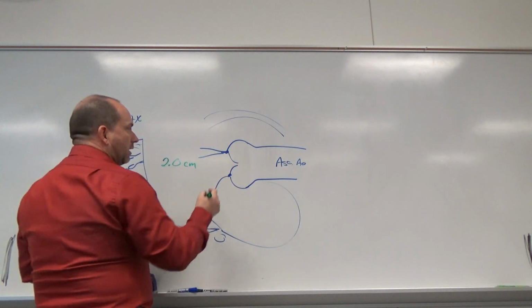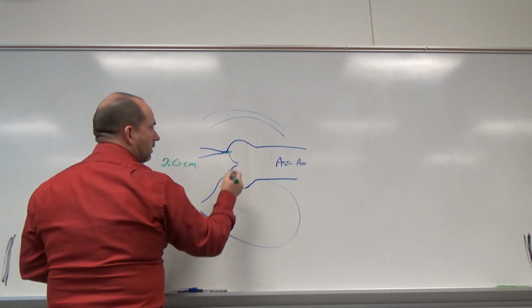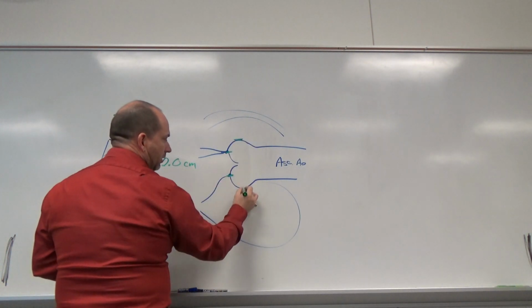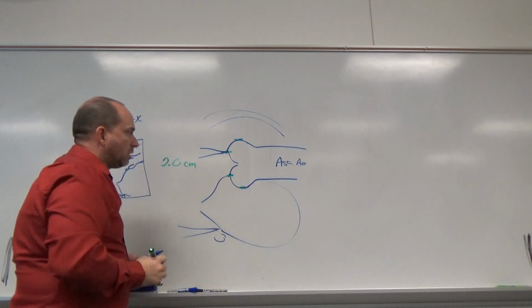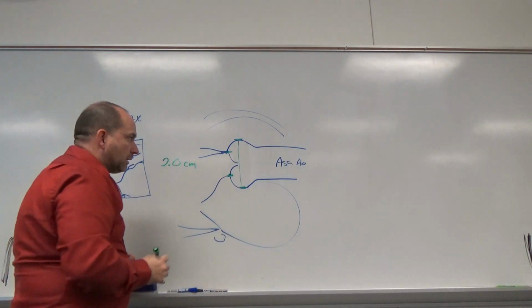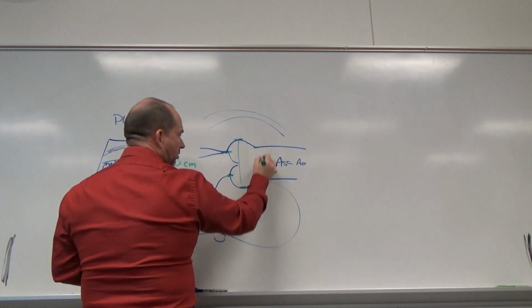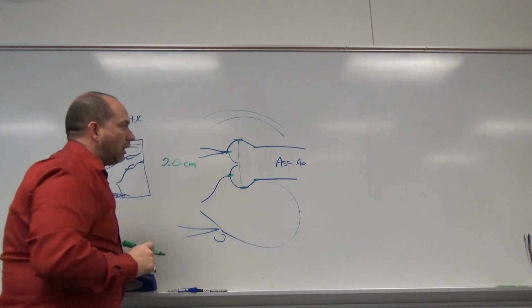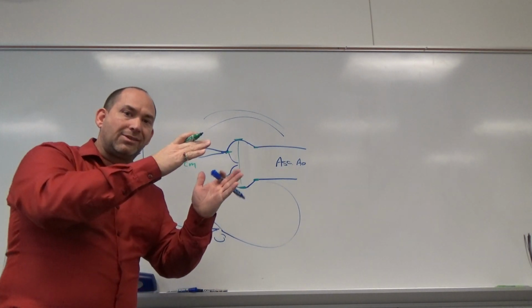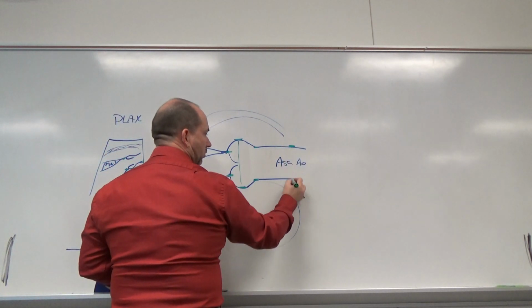If we're measuring the annulus, we would actually measure at the annulus here to here. The aortic root is actually the widest portion, leading edge to leading edge, through the sinuses of Valsalva, and then the sinotubular junction is actually from here to here. So it's where the sinuses come down and meet the tubular ascending aorta. And then we measure the ascending aorta up a little further.